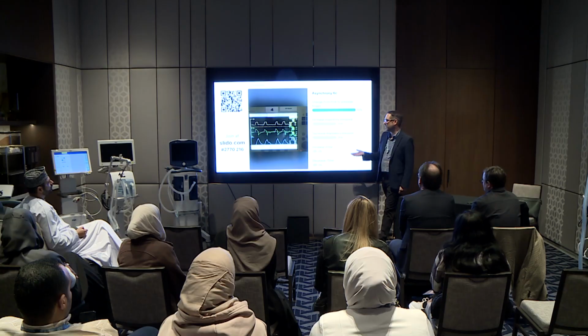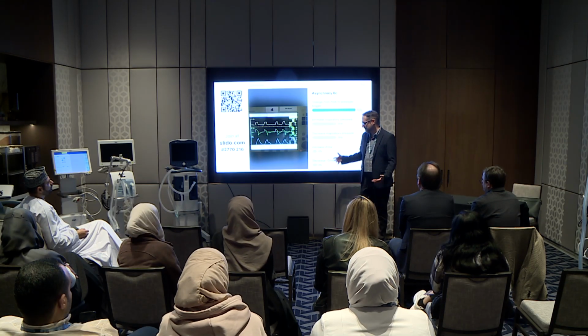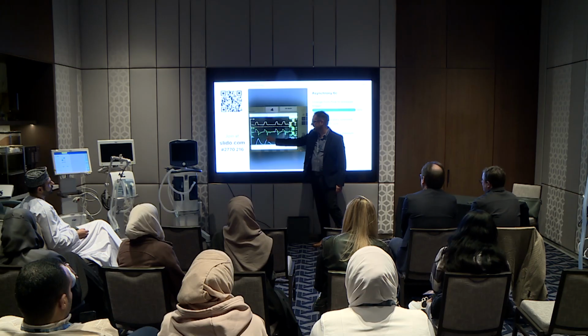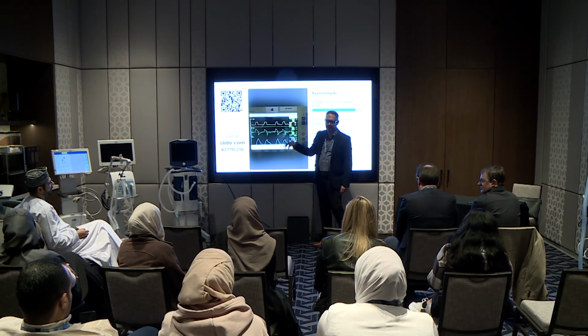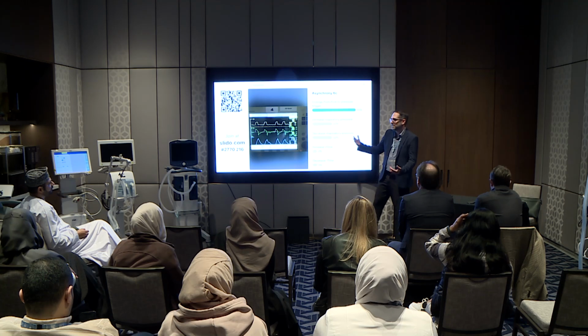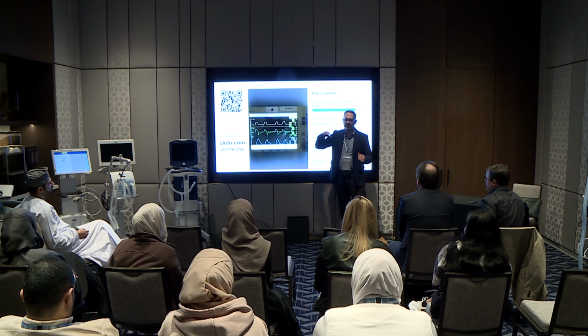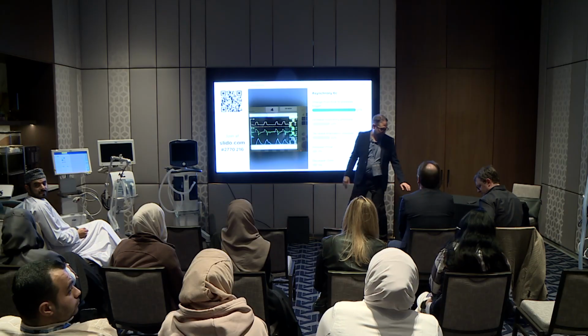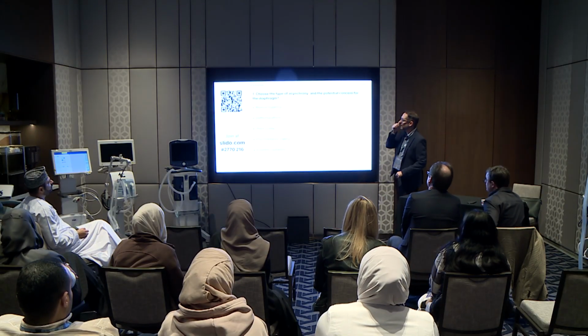So increasing inspiratory pressure might make it take longer because they get more volume. It may take longer before the auto cycling happens, but it wouldn't be the solution to the problem. But it could technically reduce respiratory rate simply by putting in more volume. It means it takes longer to get down to the part where the pressure was being triggered. Okay.